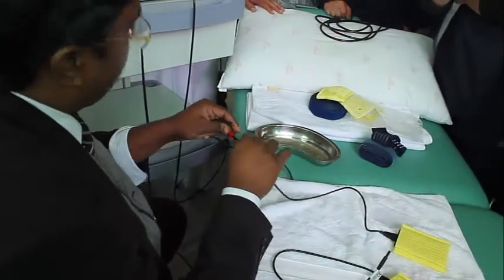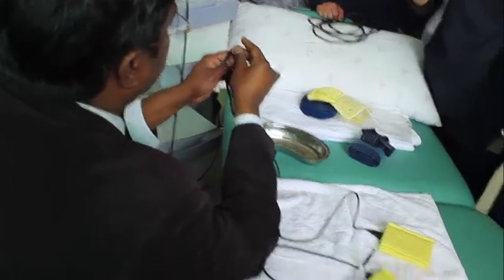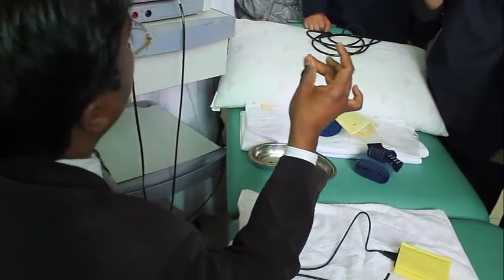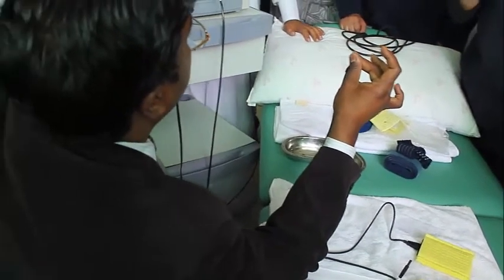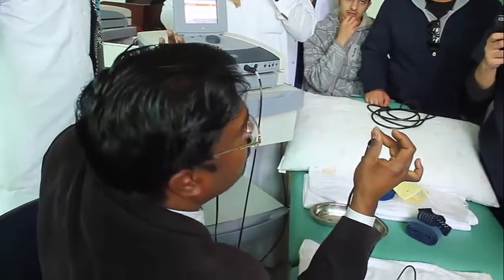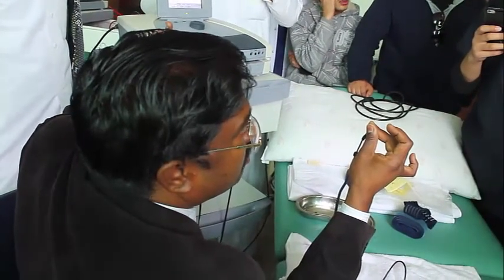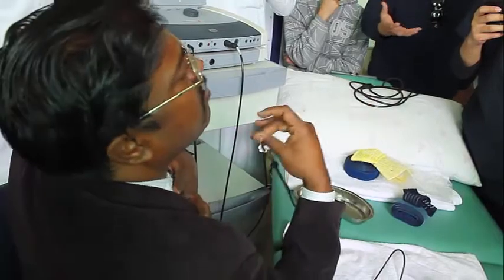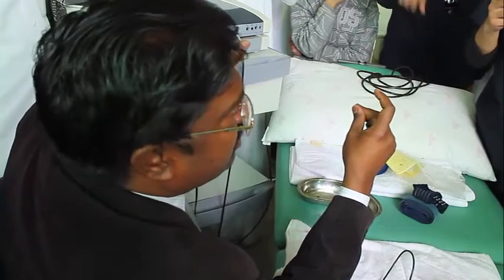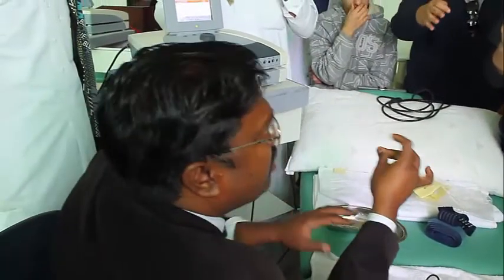Check another. Doctor, you check 2 cables. If you still don't feel the current, then you hold like this, with little intensity in your hand. You know how to control. So check it. If current is coming here, then this has no problem. But how much intensity will it be? All the intensity depends upon you, how much to increase. If you feel the current, that means it is there. You need not increase up to 17, 20, nothing like that. If you feel it, then it is there.